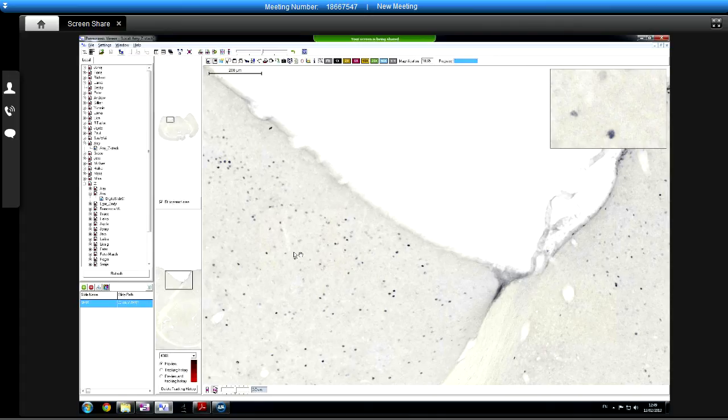Okay, is that enough for now, or is it going to be overloaded if we carry on any further? So I think the main things are you have to mark what you're going to measure. You then want to select areas of no bigger than about 300 micron squares, and I'll show you the tools to measure. One way to look at it is 1-to-1, it's about the screen area. And train it. And if you want to make it more resilient, you need to revisit your training with a few areas and different slides to try and level it off, as it were.